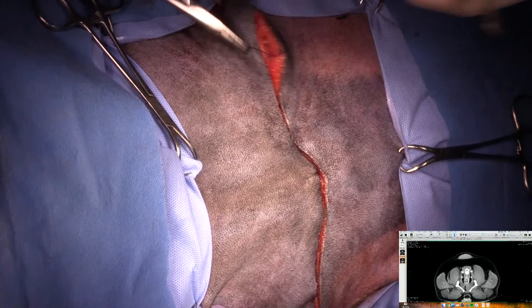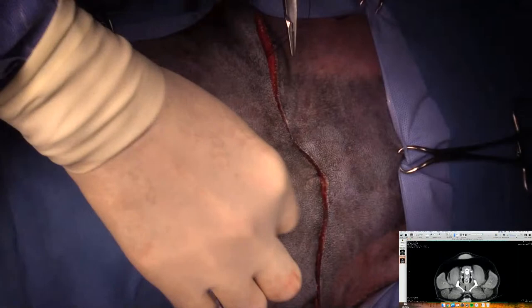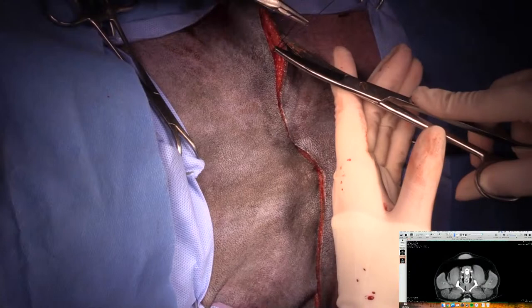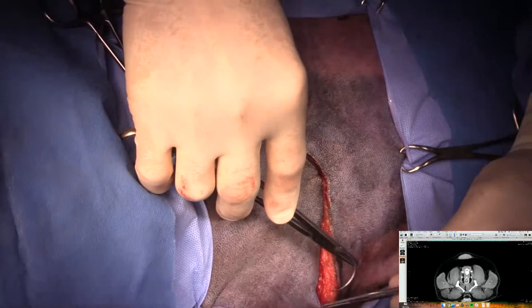Will you be worried about having too much tension at this stage? There is a bit of tension. I think we might do a Z-plasty up here cranially. That's the skin that's under tension. Back here, it's quite loose. And I love the Z-plasty.